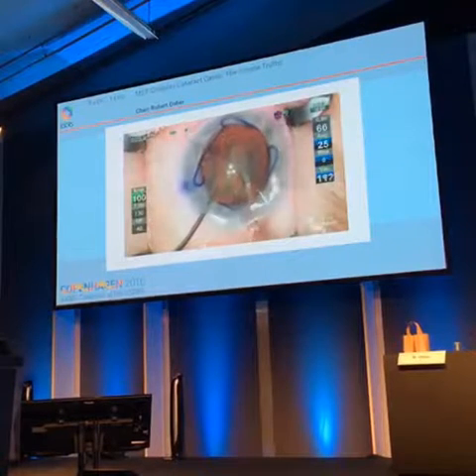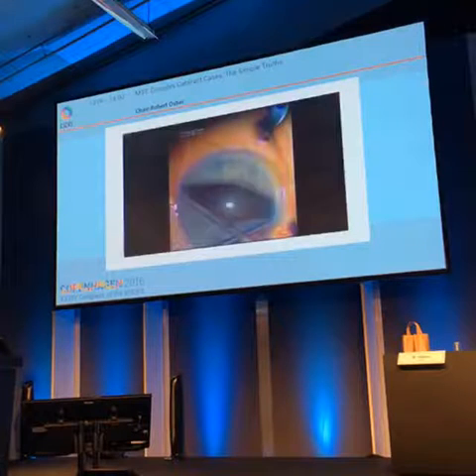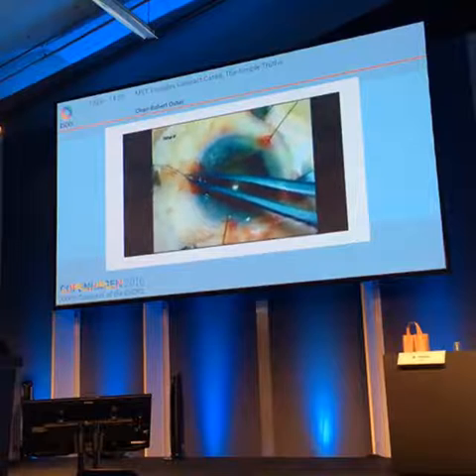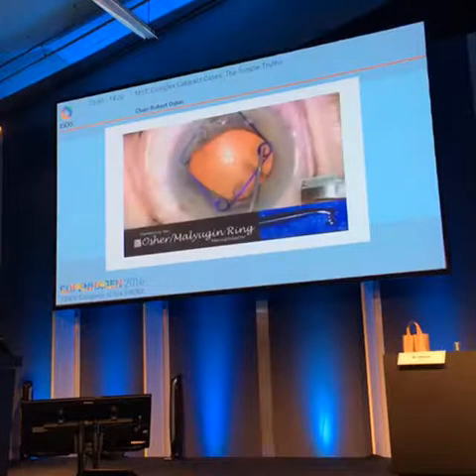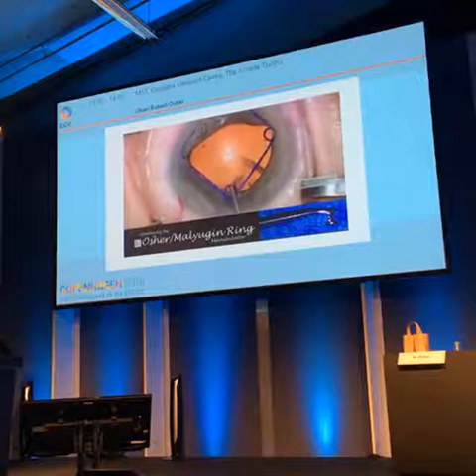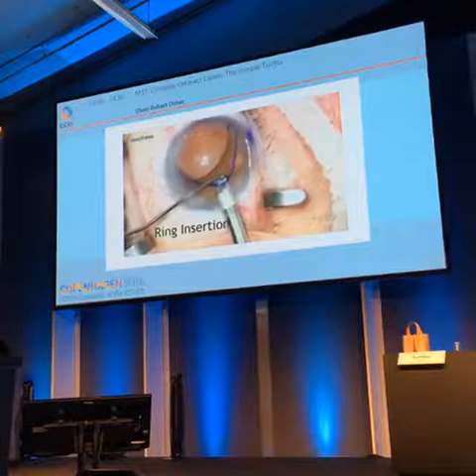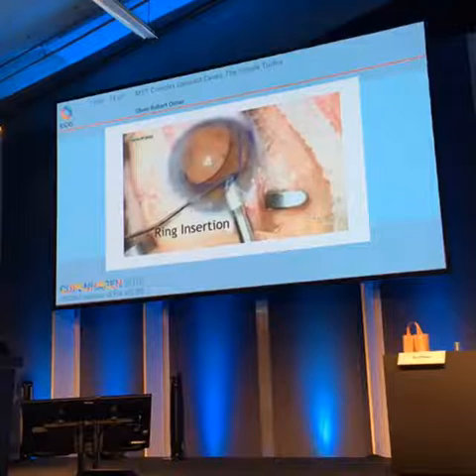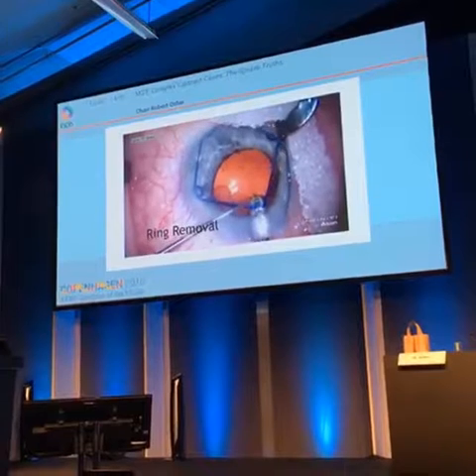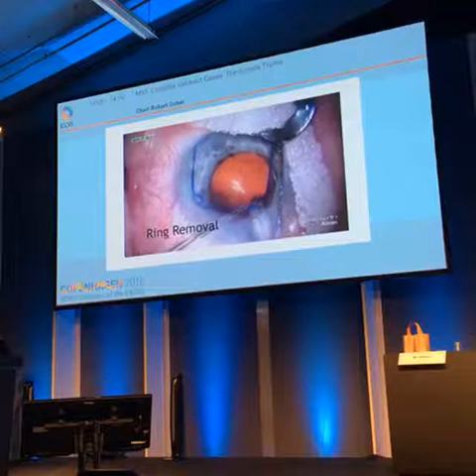The unique 4 scrolls and 8 points of fixation quickly overtook the Fry stretch technique and iris retractors as the preferred method for enlarging the pupil. That same American surgeon was privileged to design the companion scroll manipulator. Yet I had difficulty disengaging the large distal finger from the proximal scroll during the insertion of the ring, and it wasn't easy to engage the proximal scroll with the required vertical motion of the large finger during ring removal.